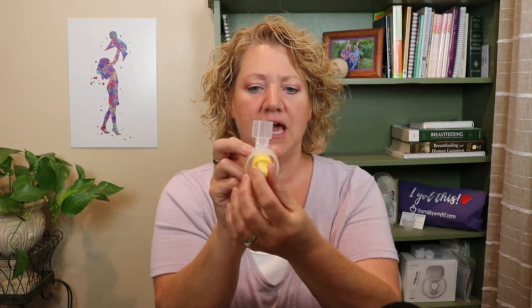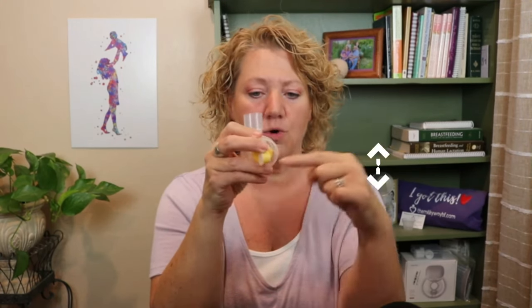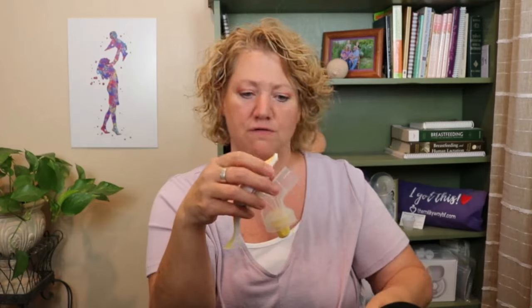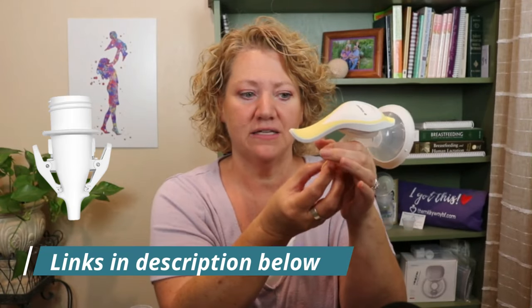For the Medela, everything just pushes firmly together. The membrane piece pushes in place and needs to be vertical — not horizontal — either vertical direction is fine. Then push the handle on firmly. The handle on this one rotates for wherever it's comfortable for you — it will move, but just needs to be pushed in well. Then your flange pushes on. The only thing that gets screwed on is the bottle. You can also get attachments to pump right into a storage bag if you prefer.